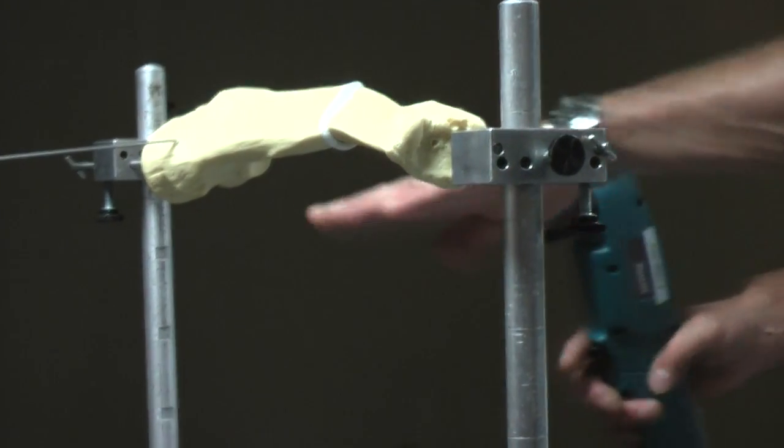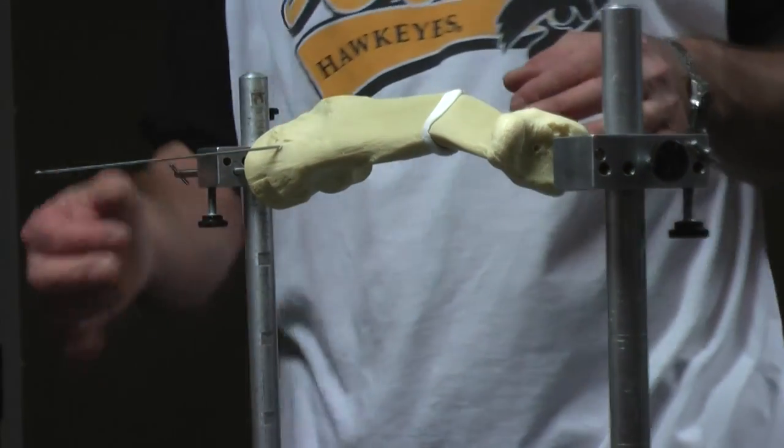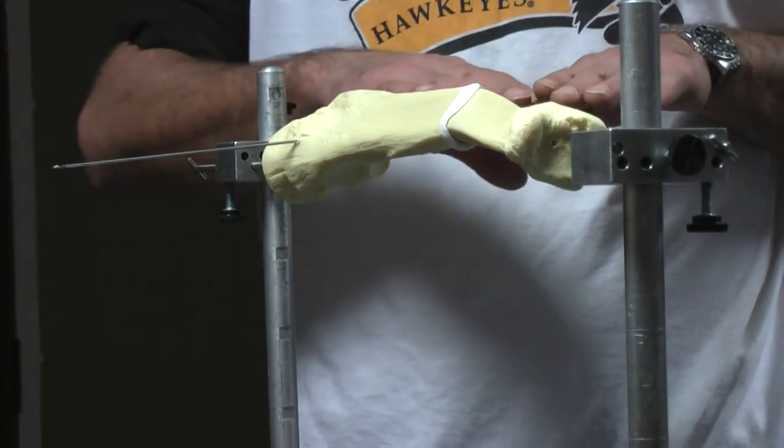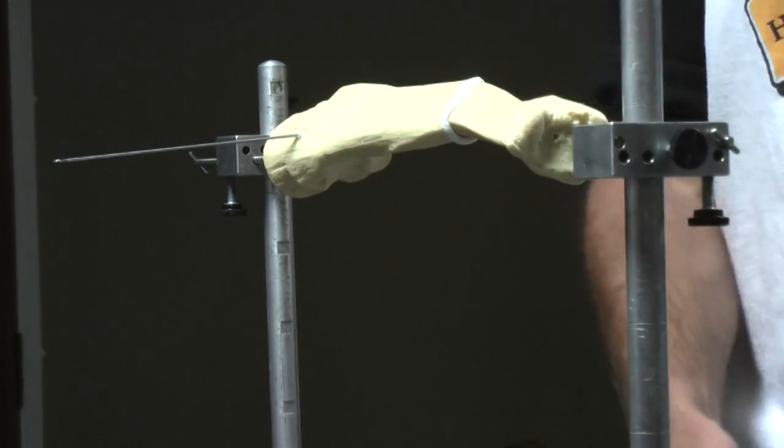And if you look at it, parallel to the floor. All right, horizontal is an easy thing. Okay, so that wire is level of the fibular head, just through the tibia, parallel to the ground. And all we're going to do then is mount this thing on it.